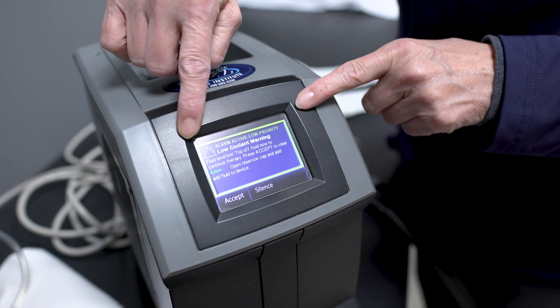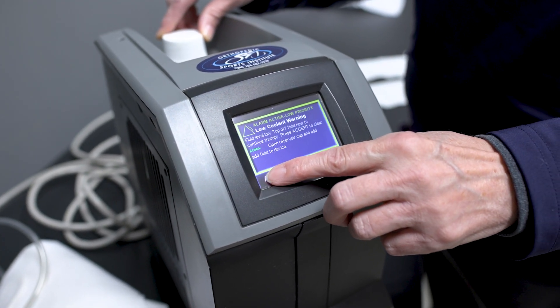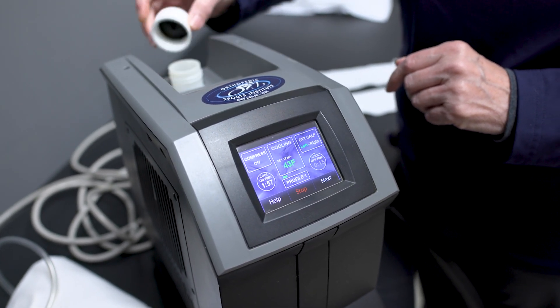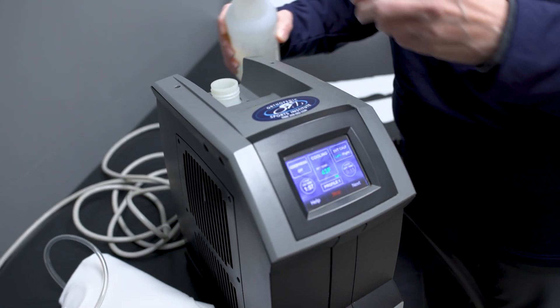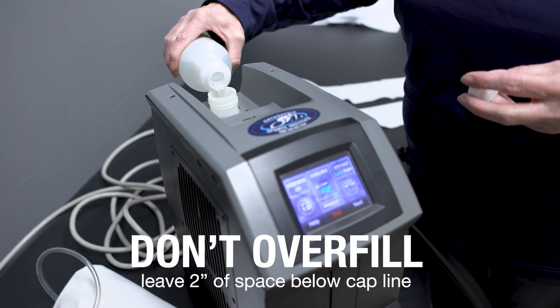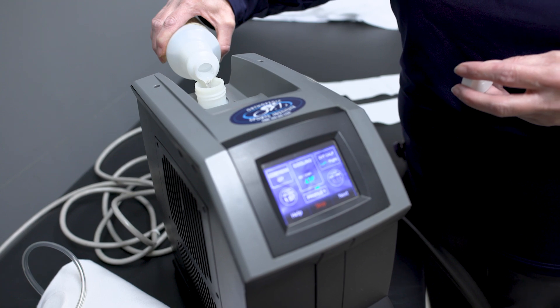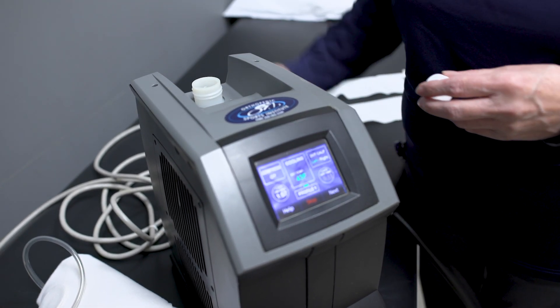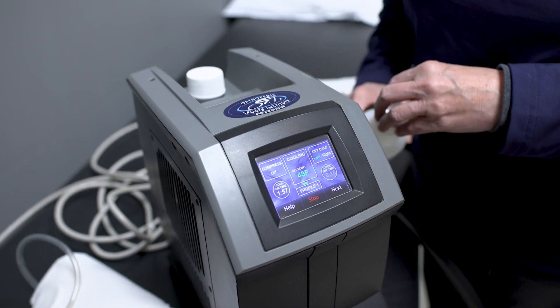If you see the indicator for low fluid, you're going to hit accept — that will take you back — and then open up the container. This is what the extra bottle is for. Just refill it, making sure it doesn't overflow. Re-seal it, and the machine will continue to go as prescribed.